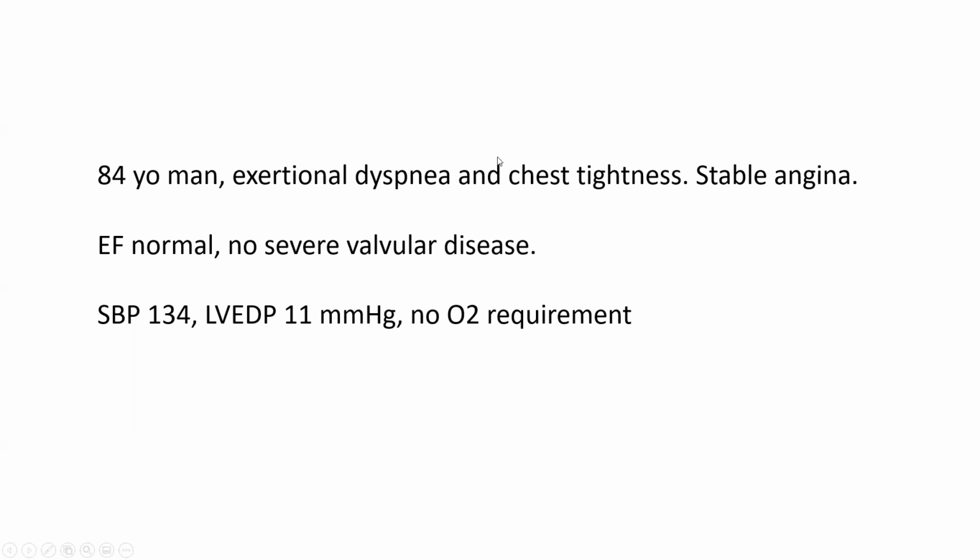I want to move to another topic, which is the left main approach in general, and specifically the left main stenting technique. And I will start with this case. So, 84-year-old man, exertional dyspnea and chest tightness, stable angina.